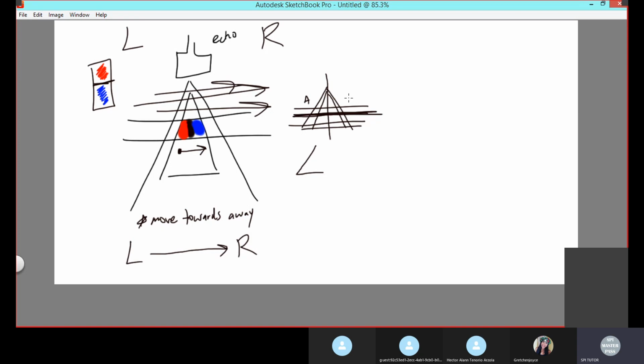For this sector image, I'm not sure, because this one is even tricky for me. I do echo, and for me, the right side that I see here is my left. So for the echoes, I'm not sure, but I know that for linear transducers, the assumption when you're scanning is that the left side of the screen is actually the right side.